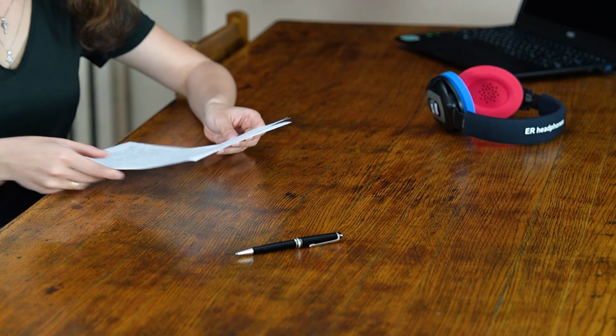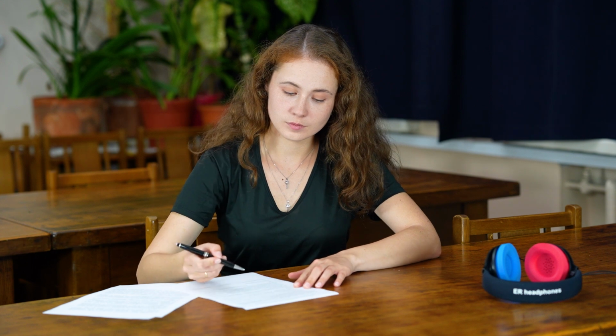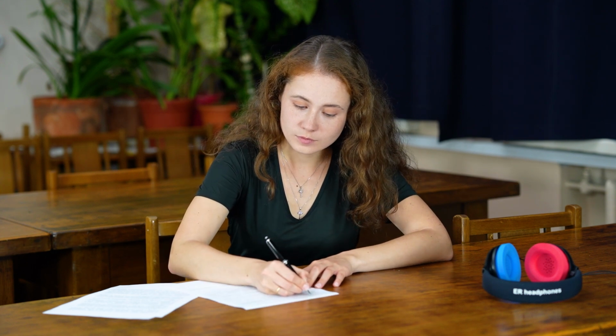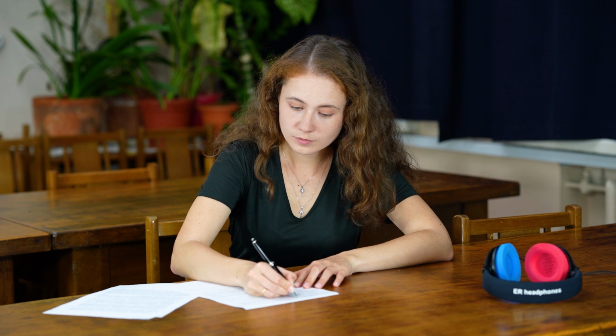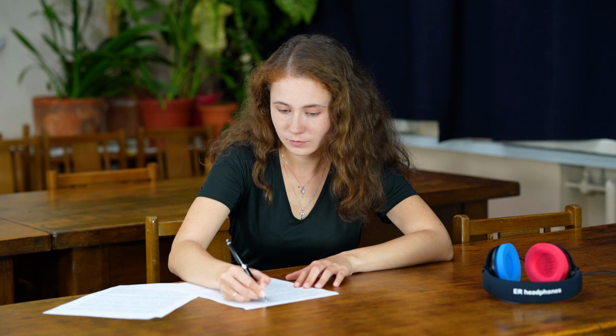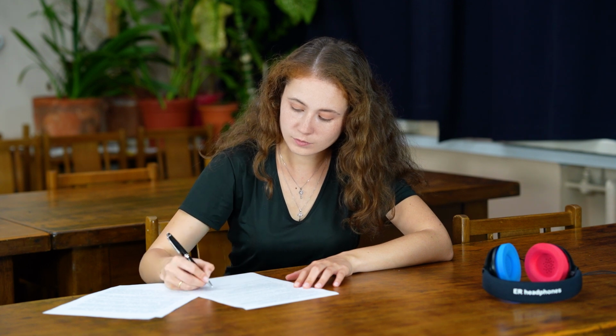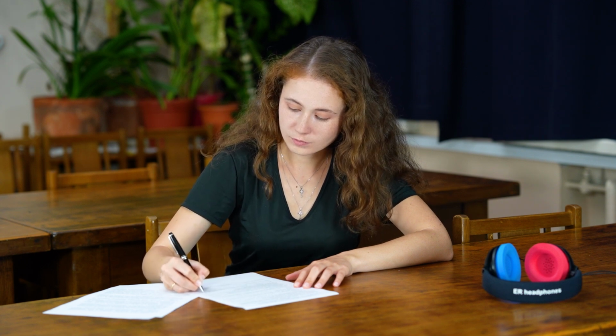According to the ethical rules, before we start the study, we have to ask our volunteer to read the participant's information, which describes in detail everything that will happen and necessarily all the unpleasant and potentially dangerous aspects of the study. After reading the description, the volunteer signs an informed consent to participate in the study. In the informed consent, the participant declares that he has received all relevant information about the study, that his decision to participate is free and voluntary, and that he can withdraw from further participation at any time if he wishes, and that there will be no unwanted consequences for him.